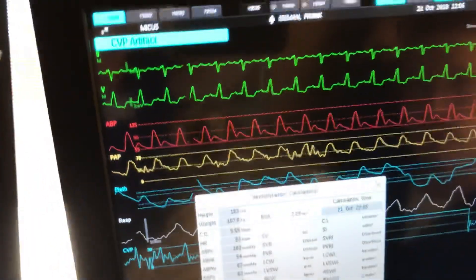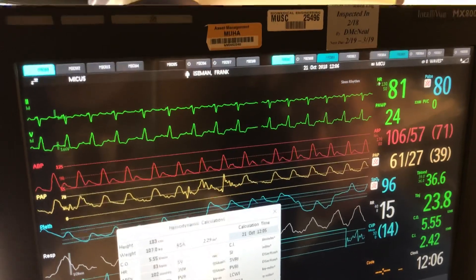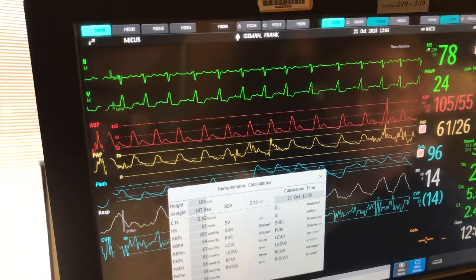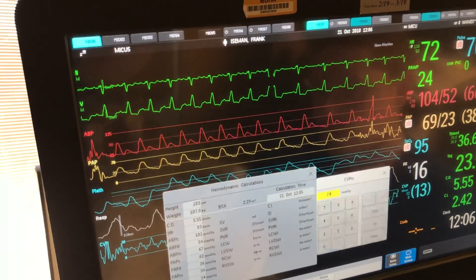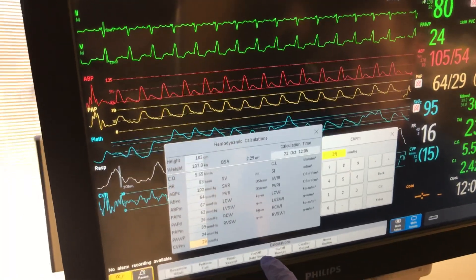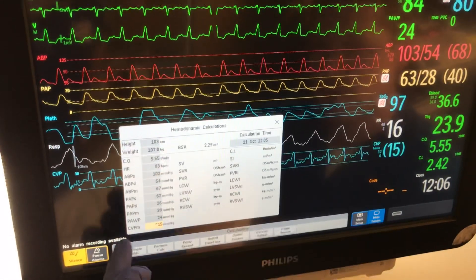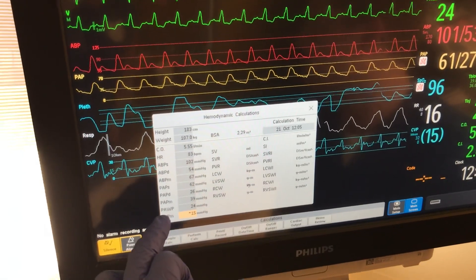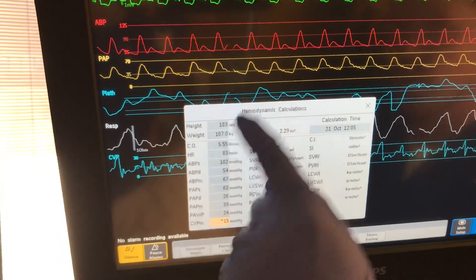There it is. So CVP — 14 or 16? 16. So this one — right there. We can do 15. That's what it was earlier too. So 15 CVP. The rest of these numbers are right. And your wedge — we did 24. That's right. If you're not able to get a wedge, then you just use a diastolic. So all these numbers are in and then you'll hit perform calc.